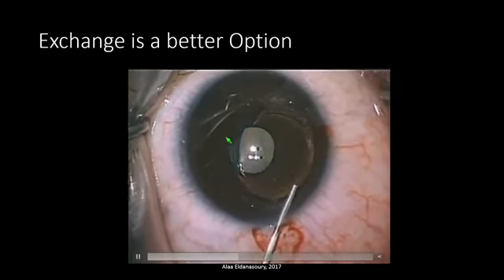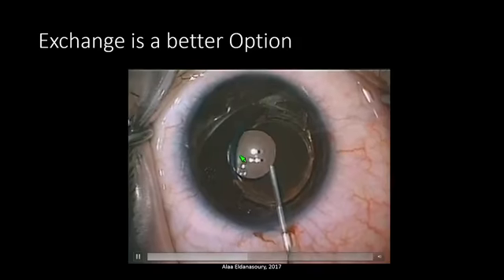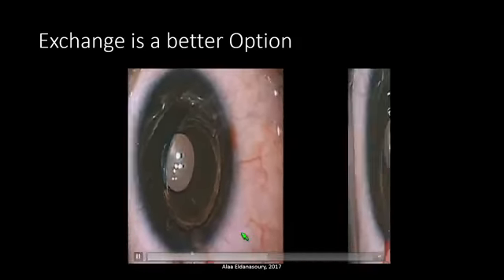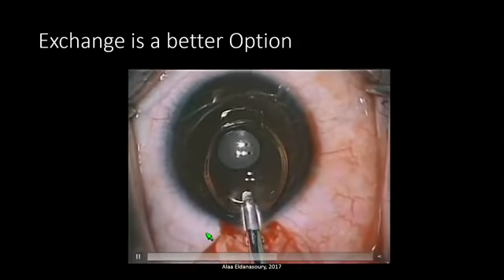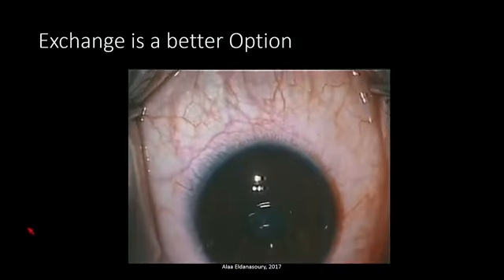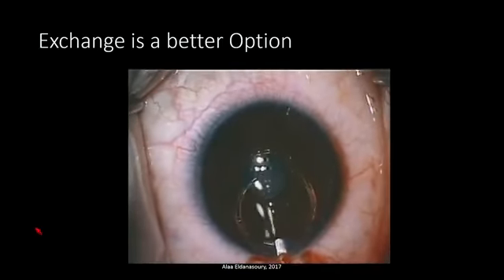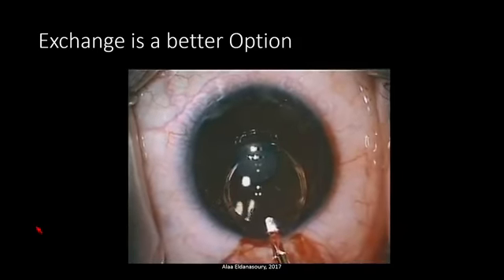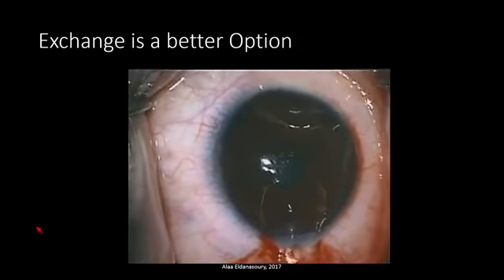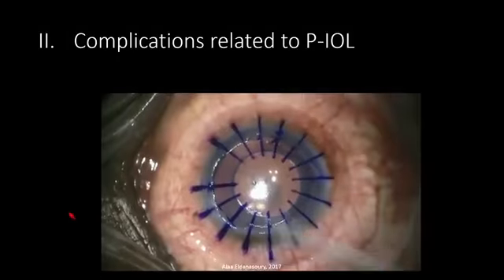The challenge here is that the optic of this lens is made of silicone, so it's not easy to get a good grip of it, but the haptic is PMMA, so you can hold it and just pull it out of the same incision. And then I usually need to do some counter pressure taking this lens out. So taking out an ICL is much easier.